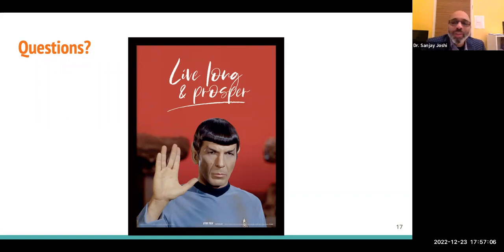Well, yes, because how did you know that your design went wrong, right? And usually you know it because either it failed a test or when your end users looked at it, they said, no, this is not going to work. And that should be in the record of your formative evaluation. When you, during the design and development, showed something to the user, you need to record what you showed. Now, it could be in the form of just a photograph or a UI mockup. It doesn't have to be a finished product.